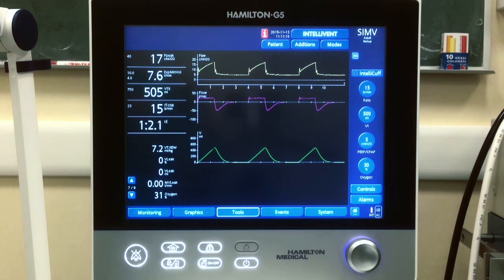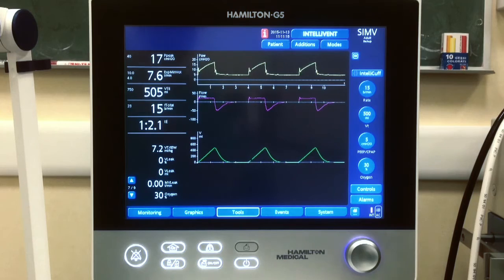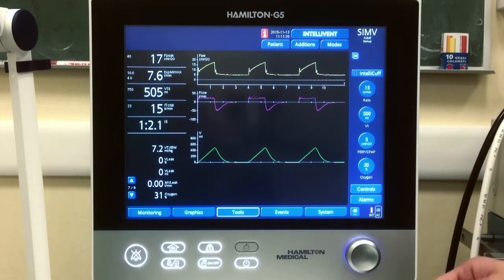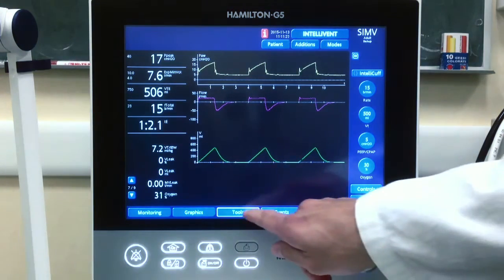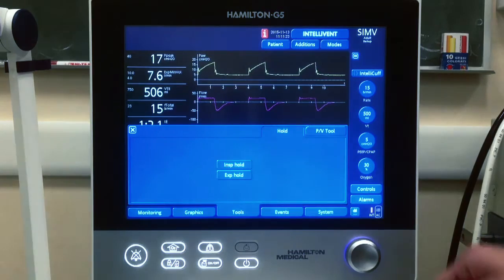This is how we can draw a pressure volume curve within Hamilton G5. We go on tools and then choose the PV tool.